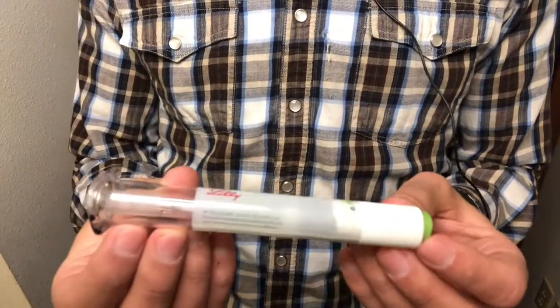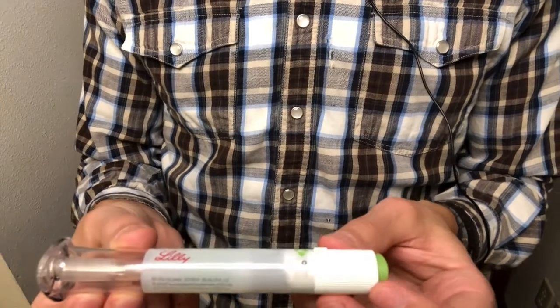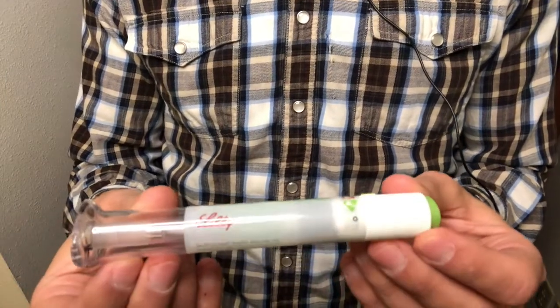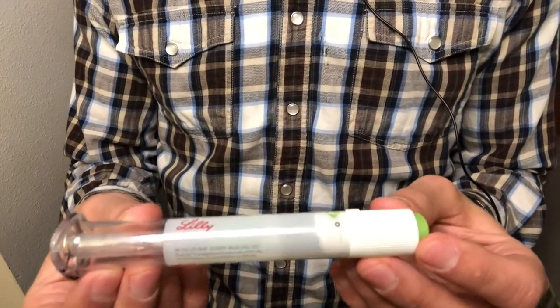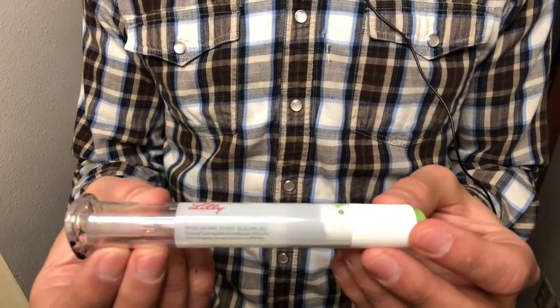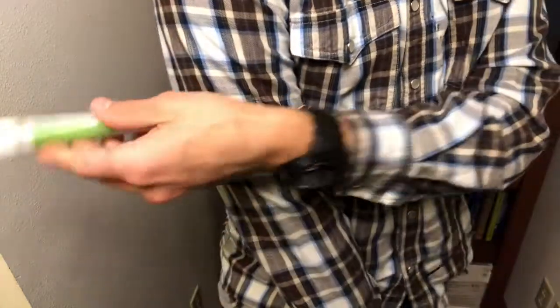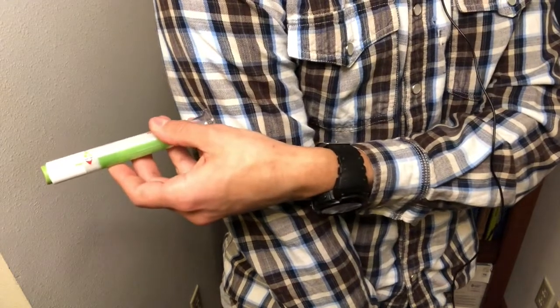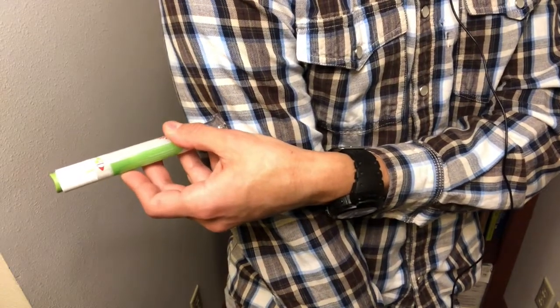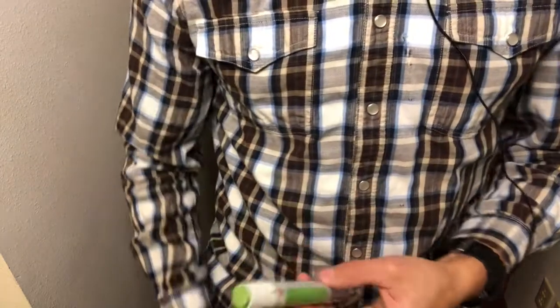So now that we pulled off the cap, the next step is to choose where you want to inject the pen. So there are 3 places that are commonly used to inject. You can actually use the back of the arm. So some people will reach back and use the back of the arm. Some people have a hard time doing that. So you might have a family member or caregiver help there, but you don't have to use the arm.